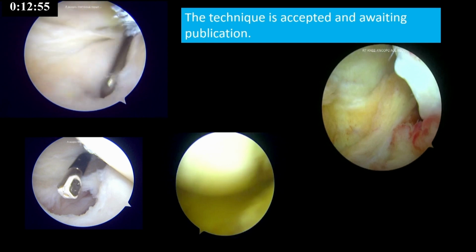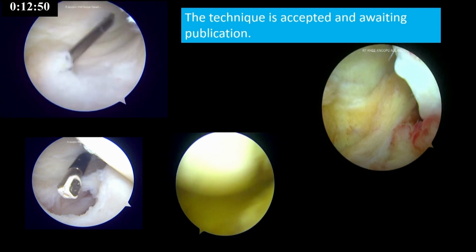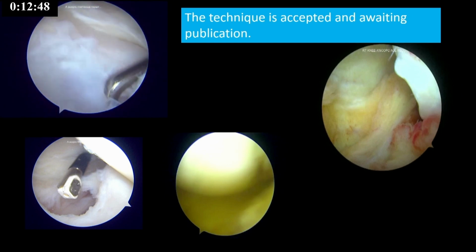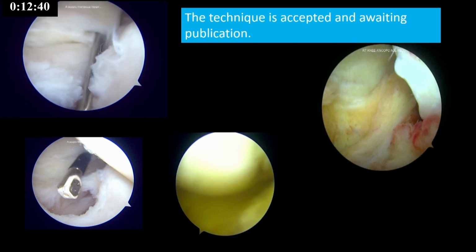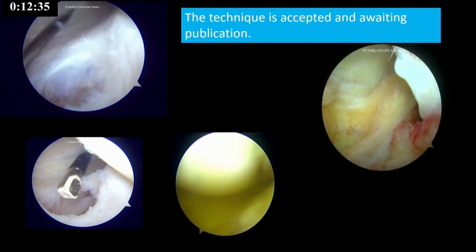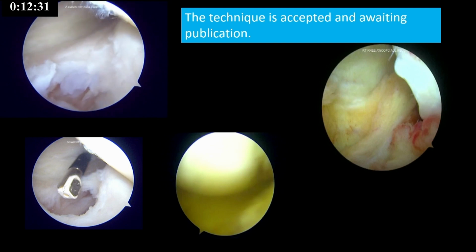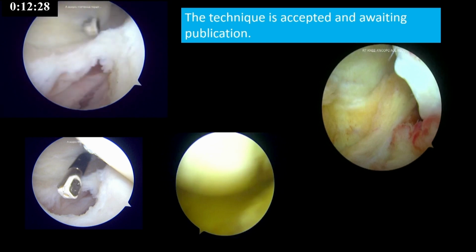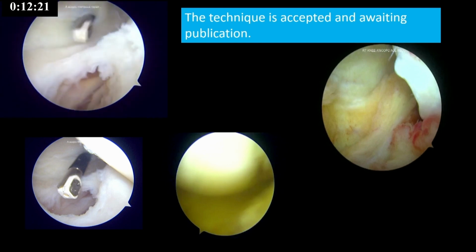This was a multiloculated cyst, and we thought that we should dissect this posterior side layer by layer arthroscopically, because it has already been done histologically, to see how it looks. So that is how the cyst looked. The cyst wall was taken off, and now you can see the posterior horn is absolutely free of attachment. That's the inferior surface of the meniscus. From there the capsule starts, and right from Strobel everybody had said that the ramp lesion occurs at the ramp and doesn't occur at the meniscus. The 2019 ESSKA consensus also says that a ramp lesion does not consist of true meniscal tissue.